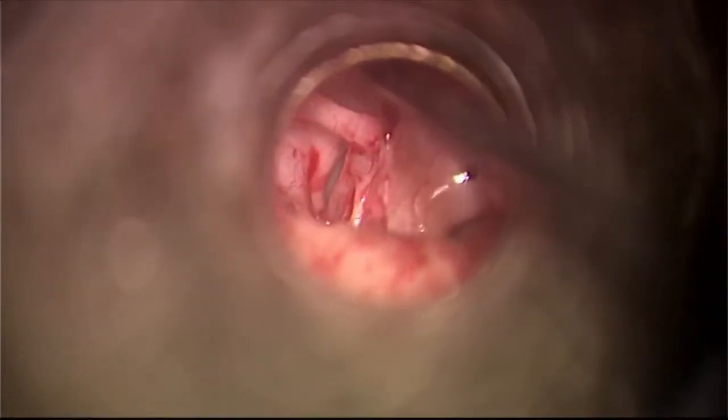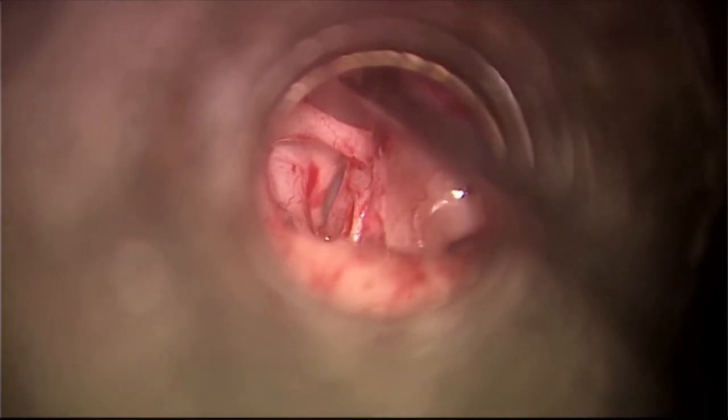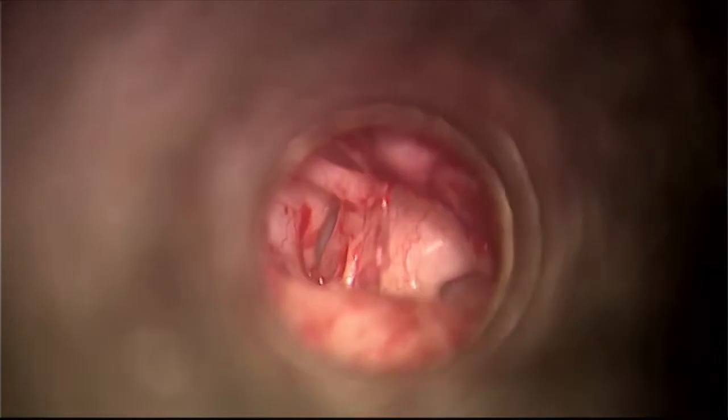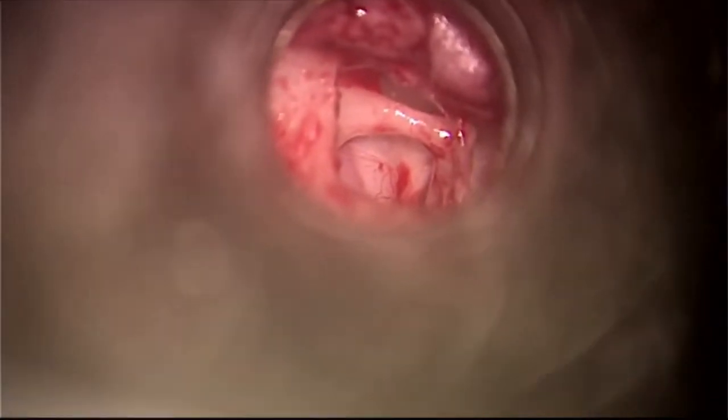So first of all, see the mobility. I am focusing on the footplate now. How much is the ideal removal of overhang? Yes, see now, I mentioned: you should see the long process.